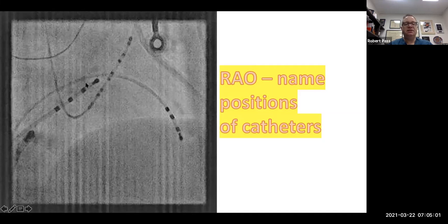And the His catheter typically has a minimum of 4 electrodes, but a lot of laboratories will use a hexapolar catheter with 6 electrodes. What we do in our particular lab is we record from the distal electrode to the second electrode, then from the second to the third, and then from the third to the fourth, so that we project on the screen 3 His electrogram signals. Some labs will even put a decapolar up and want to see a His on all of the leads, and it can take quite some time to get it in perfect position for that.